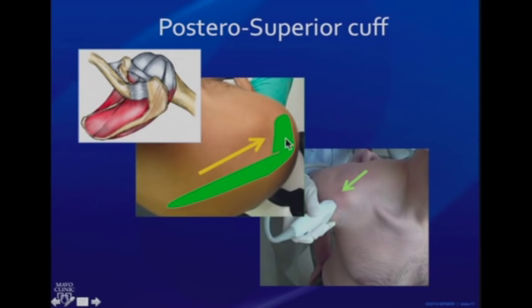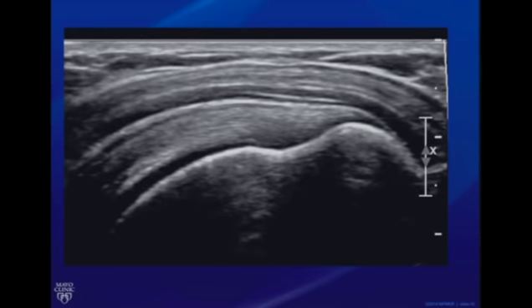This is the acromion and the spine of the scapula. This is your bird's eye view. This is the orientation of the transducer so that you can look at the long section of the supraspinatus tendon. And if everything is perfect, then this is what you should see. There is no shadowing from the acromion because of the modified CRAS position. We have pulled out the tendon far laterally. Now in this structure, it is very easy to understand the anatomy.